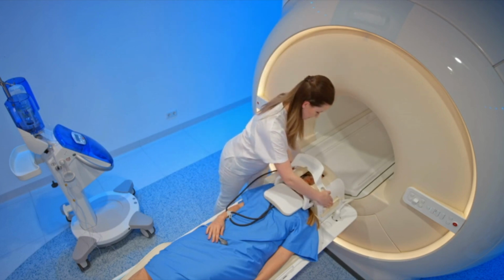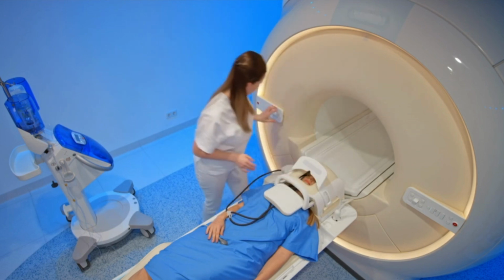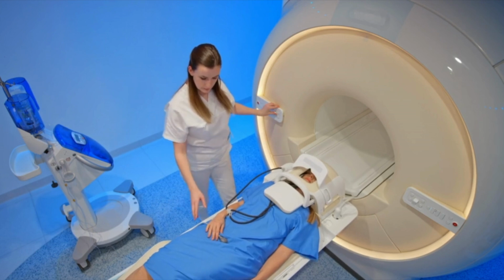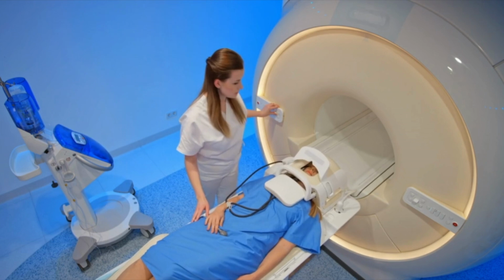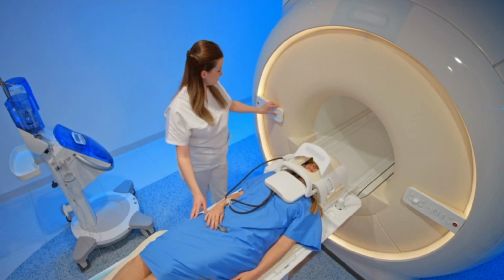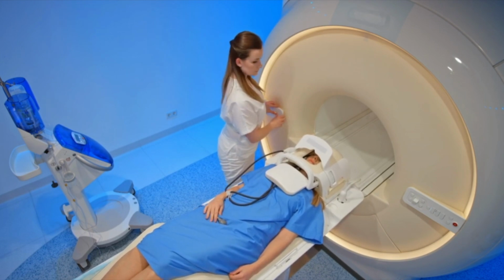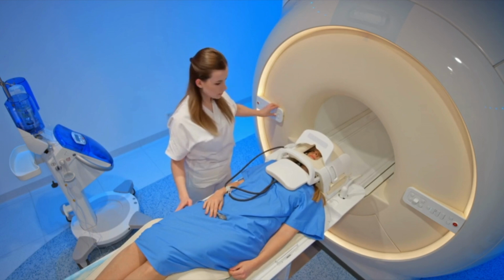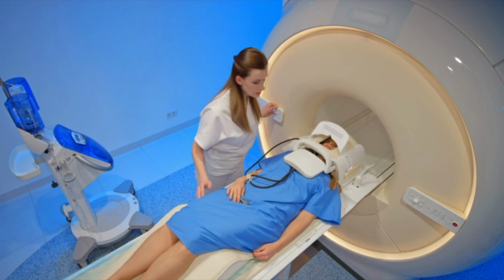So it is non-invasive. MRI typically does not require incisions or invasive procedures, making it safer, more comfortable for the patient. There is no exposure to ionizing radiation. So unlike X-rays or CT scans, MRI does not use ionizing radiation, which of course reduces the potential risks associated with exposure. And MRIs provide detailed, high contrast images of soft tissues, allowing for accurate diagnosing of various conditions. There are a couple of safety considerations here.